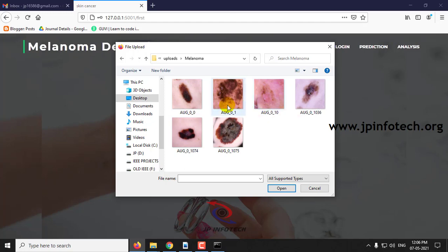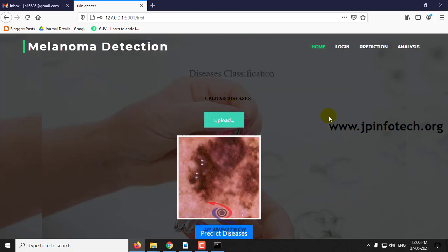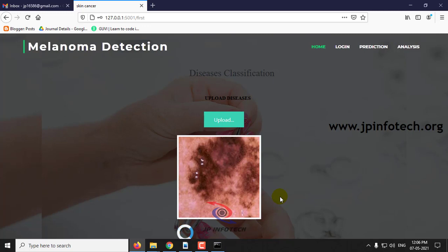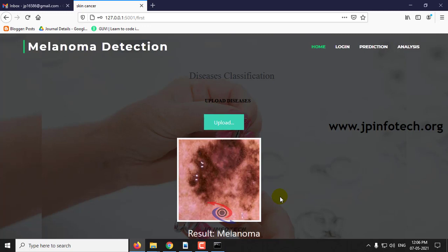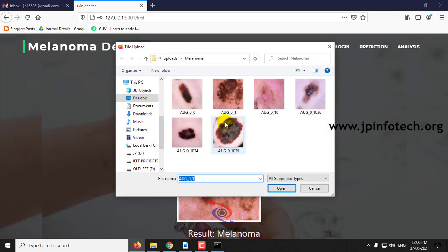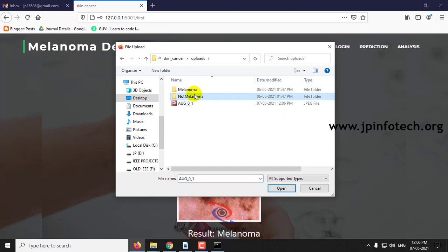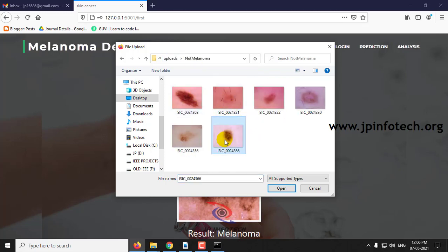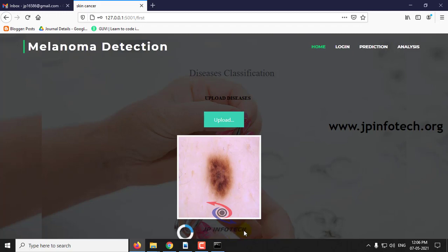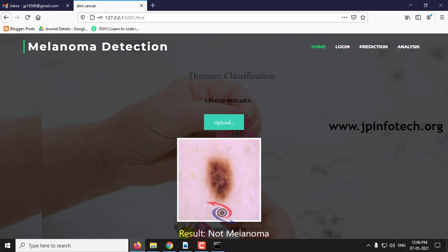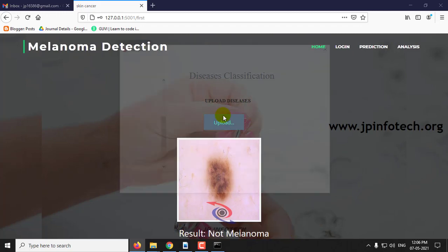You can check any dataset image and select it. You can preview it, and after that click predictor. The result is melanoma.